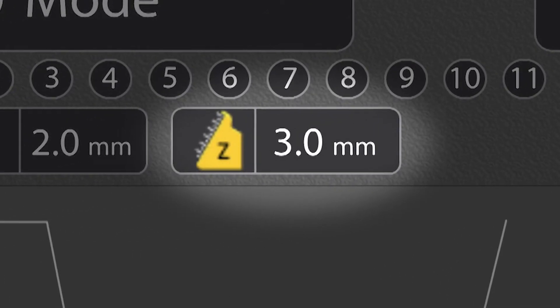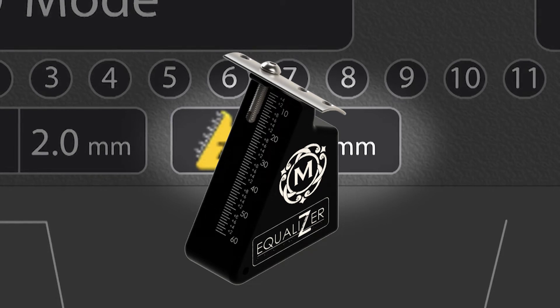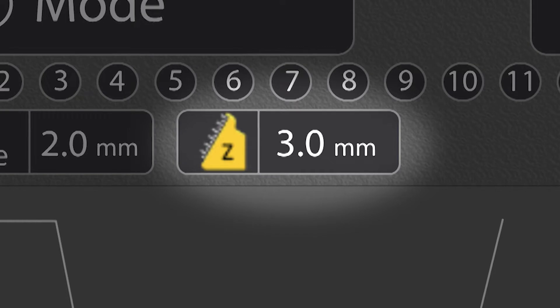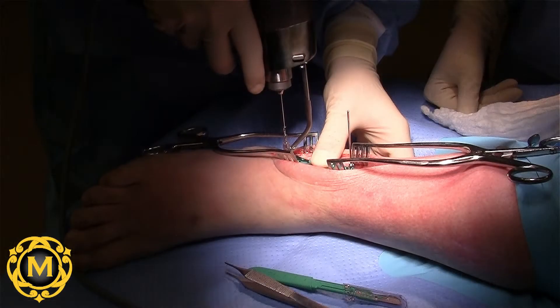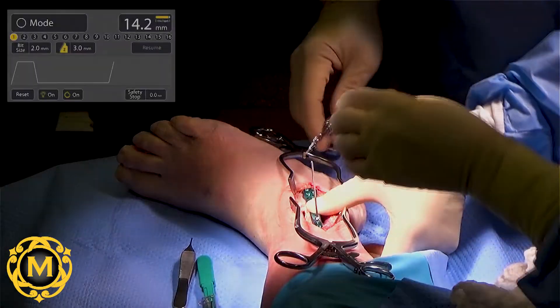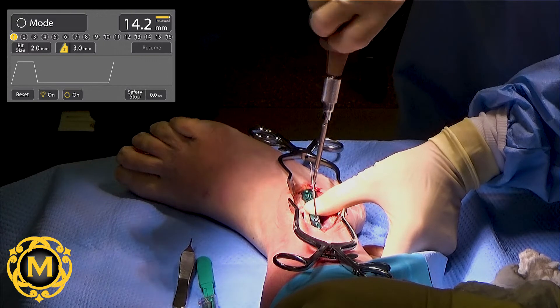This measurement also accounts for the hardware offset. Hardware offset is a measurement of the thickness of the implanted plate, calculated with the Equalizer Offset Reference Guide, also provided by McGinley Orthopedics. Measuring the hardware offset and entering it into the IntelliSense controller settings enhances screw selection accuracy by accounting for the contributions plate thickness makes to the needed screw length in order to have adequate screw purchase in bone. IntelliSense measurements are accurate to 0.6 mm with a confidence level of 99.7%. With the IntelliSense measurement of 14.2 mm, the surgeon was able to forego a manual depth measurement step and automatically selected a 2.7 mm by 14 mm screw.